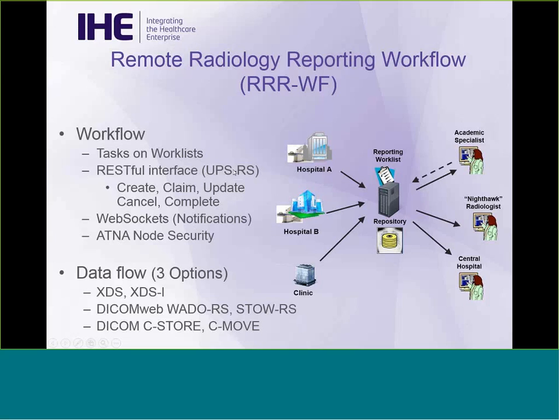It mirrors a lot of what was done with modality work list, which is what all of the modalities use to run their patient work list when they're doing the acquisitions. The notifications use WebSockets, and for handling security, we basically point to the ATNA node security profile.